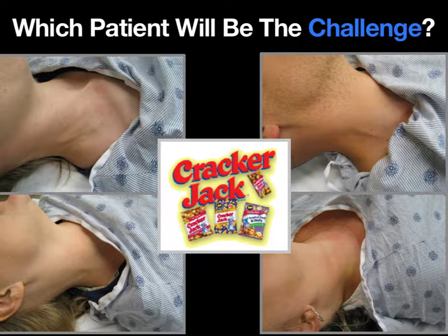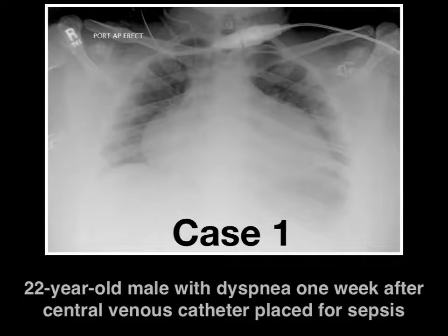I look at patients as being much like Cracker Jacks. There's always going to be a surprise inside every one. Unfortunately, when you're performing procedures, that surprise is never good, and this is where ultrasound guidance is crucial. Let's just briefly look at a couple cases that had central line complications.